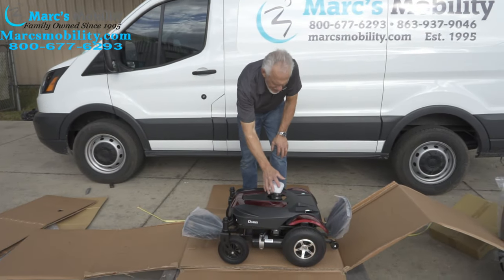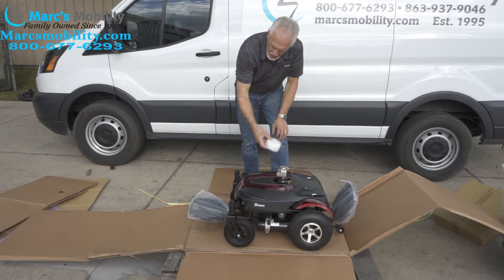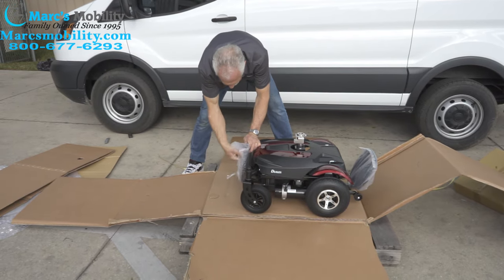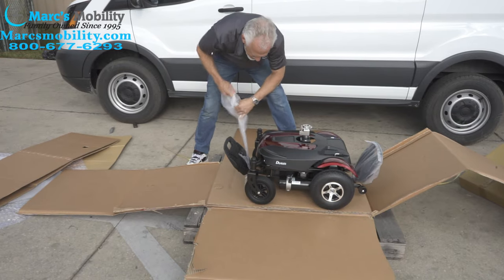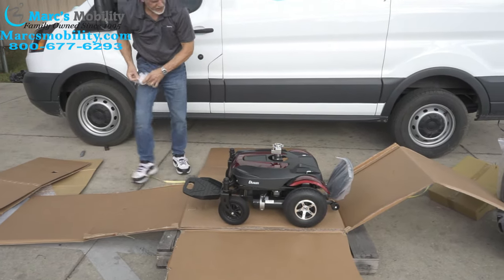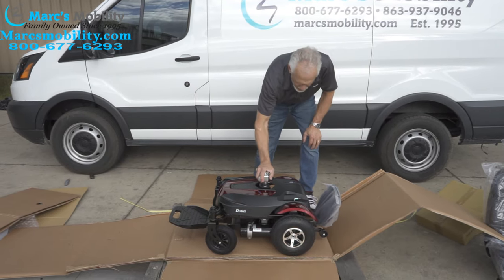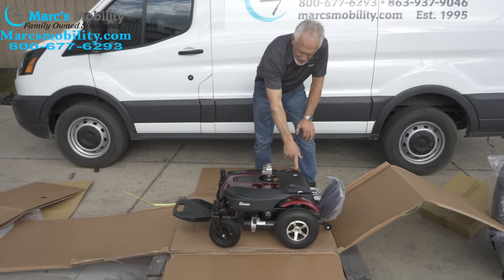Now we've got the base. I'm going to take this little protective cover that goes over the seat post right here and get rid of that. We're going to get rid of the foot plate. There's a foot plate on both ends on this chair. Now that we have the seat off, you can see the neutral levers on both sides — one here and one here.